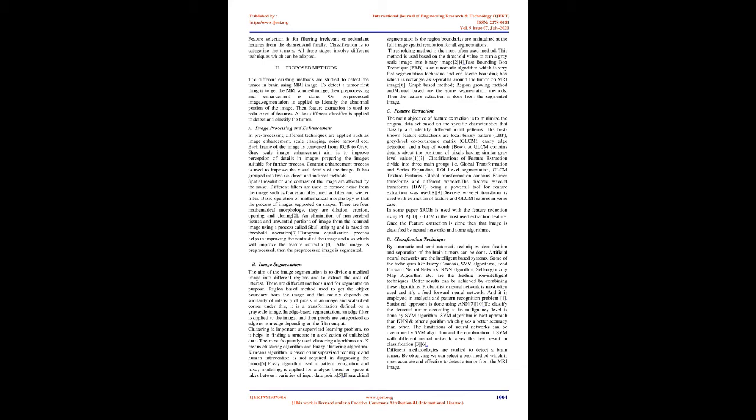Clustering is an important unsupervised learning problem, so it helps in finding structure in a collection of unlabeled data. The most frequently used clustering algorithms are the k-means clustering algorithm and the fuzzy clustering algorithm. The k-means algorithm is based on an unsupervised technique, and human intervention is not required in diagnosing the tumor. The fuzzy algorithm, used in pattern recognition and fuzzy modeling, is applied for analysis based on the space between varieties of input data points.